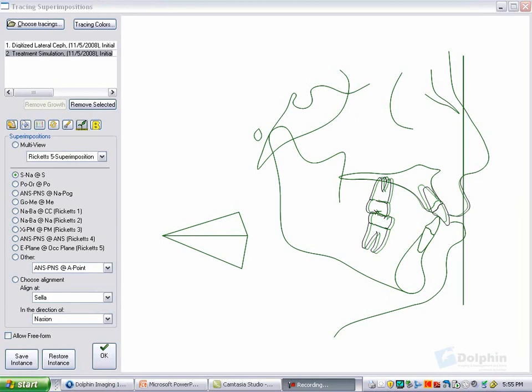Now this information is very valuable to us for the dental VTO. We are going to carry the information, particularly on lower incisor position, to our dental VTO and carry out the dental VTO.